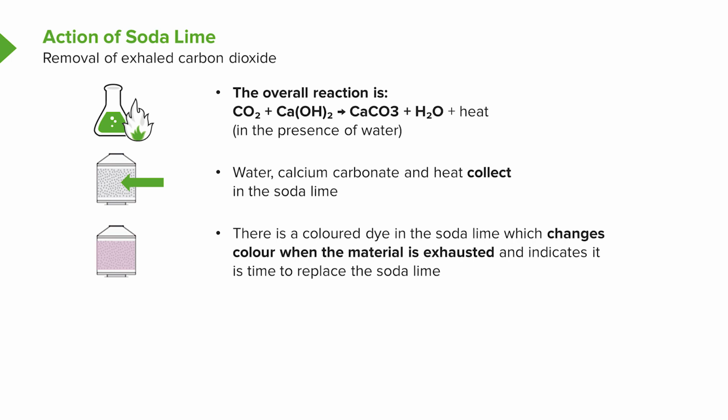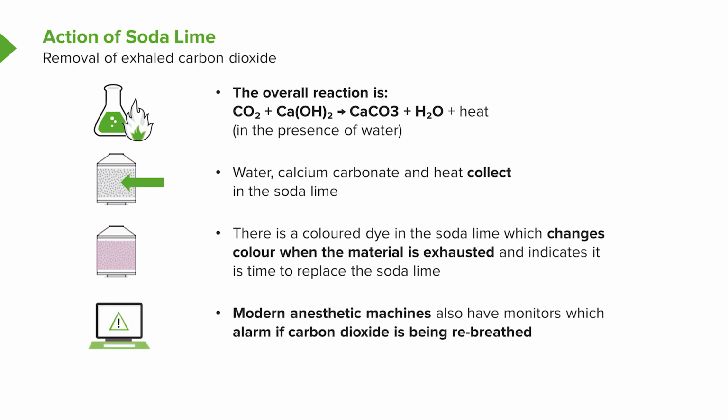The anesthesiologist hopefully notices it, and in addition to the soda lime changing color, the expired and inspired gases are being monitored, so it's possible to see if carbon dioxide is building up in the circuit and the patient is rebreathing carbon dioxide, which is a situation we simply can't allow to happen.